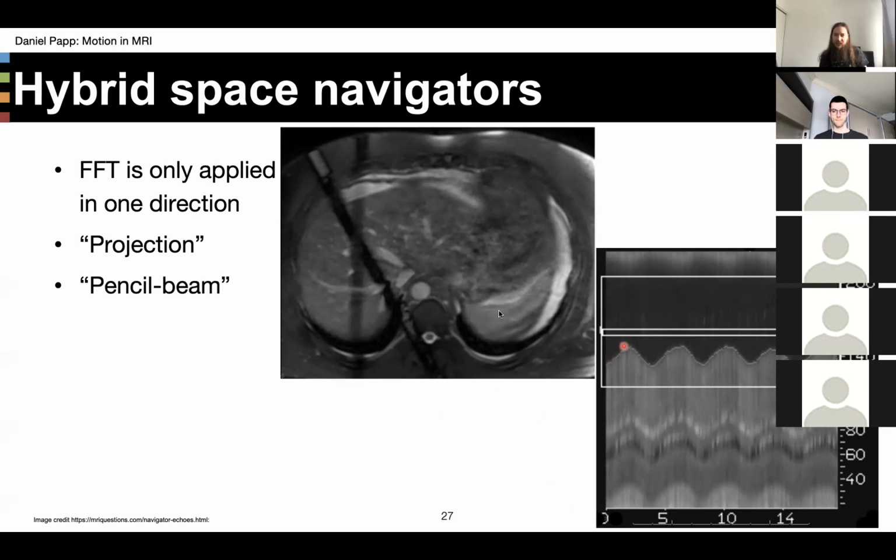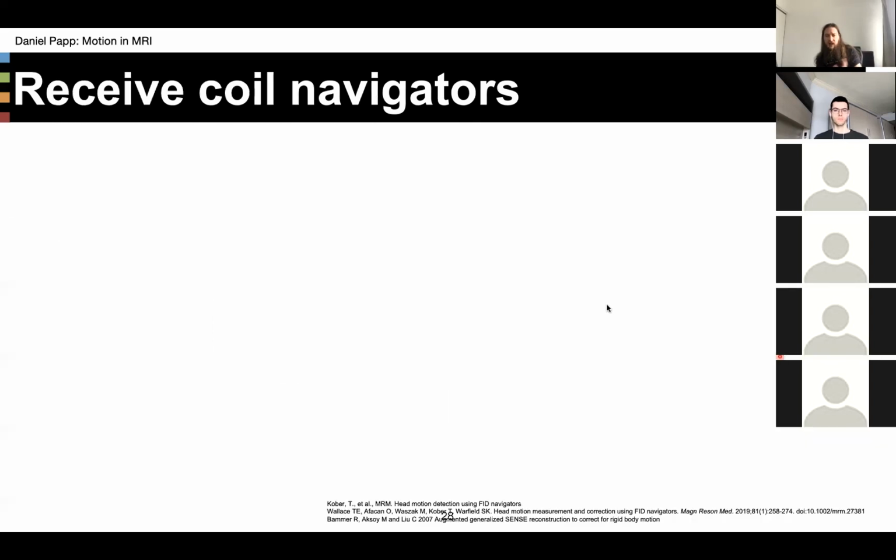And then what this tells you here is the signal intensity, the amount of k-space energy in that signal, and that will obviously correspond to, in our case, physiological motion, e.g. breathing. That's what pencil beam navigators are used for, abdominal imaging and then breathing. And a really cool idea, and they were the first to be developed, I think.